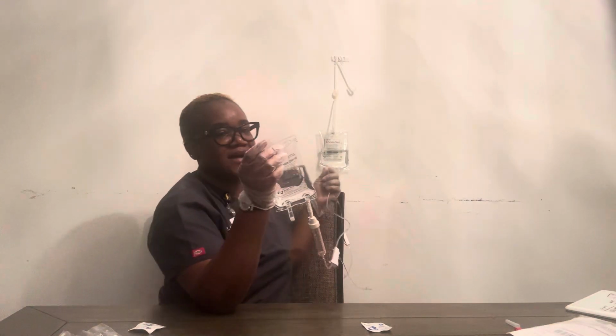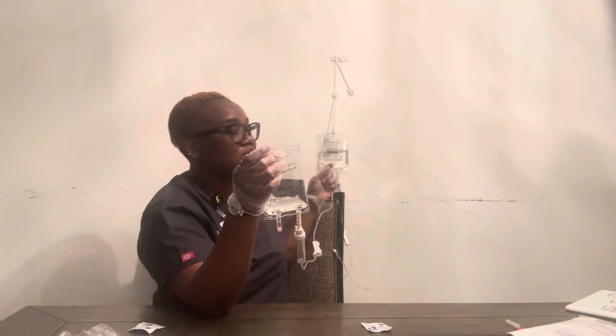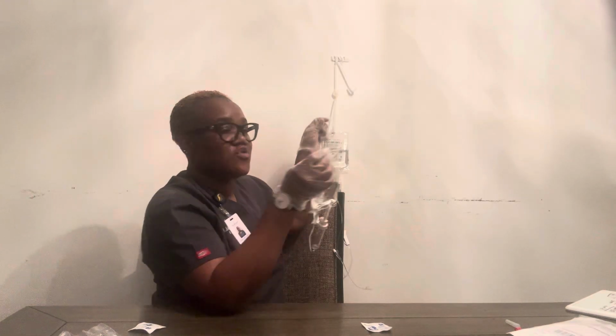When you're spiking the bag, you want to make sure that the roller clamp is in an off position, so as not to allow the fluid to run all the way through. Because it's medication, I'm gonna hang it above my fluid.